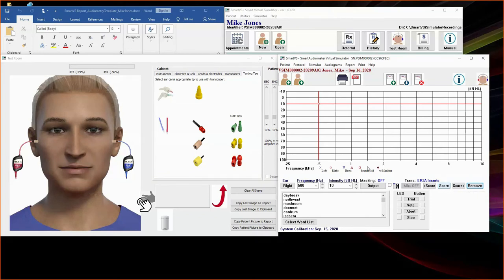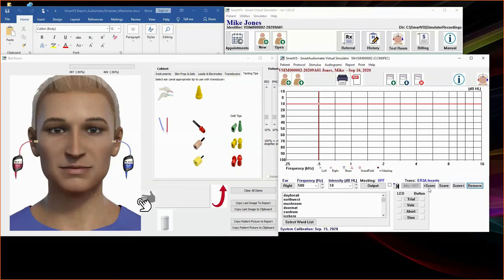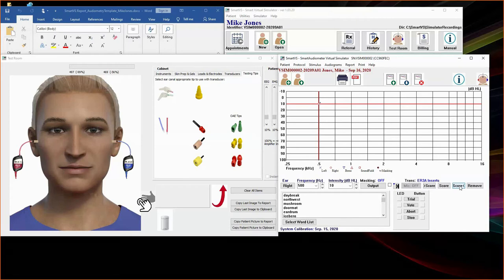Once you have identified a threshold, you can double-click on the intersection point to score the threshold or use the score button. There are several symbols that will be used to score the threshold. The blue X and red circle will be for air conduction left and right ear thresholds, respectively. While the blue upside-down triangle and the red triangle will be for the left and right bone thresholds. Soundfield scores are represented in red and blue squares. And if masking is used, a black dot will be present within the symbol. You can use the greater than score button if you wish to indicate that the threshold may be higher, or the score less than button if you wish to indicate that the threshold may be lower. To remove a score point, simply select the remove button.